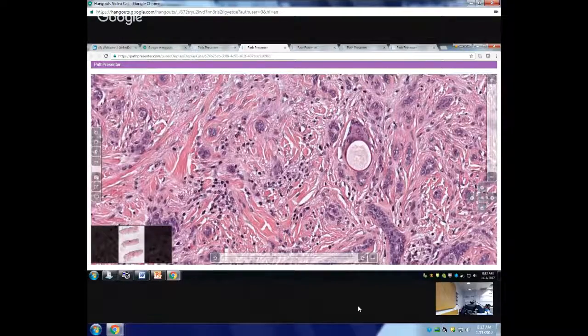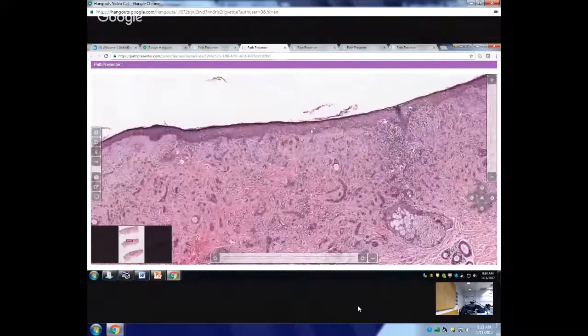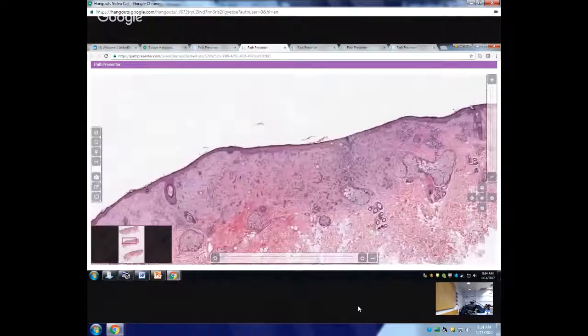So you have this keratocyst admixed within the basaloid neoplasm, and the very fibrotic stroma, and then we already talked about all the features of a basal cell carcinoma, how you rule that out. So when you see something that looks like an infiltrating basal cell carcinoma, but has this keratocyst admixed within it and does not have all the other features of basal cell carcinoma, your main differential diagnosis is going to be a trichoepithelioma. So this is a trichoepithelioma.